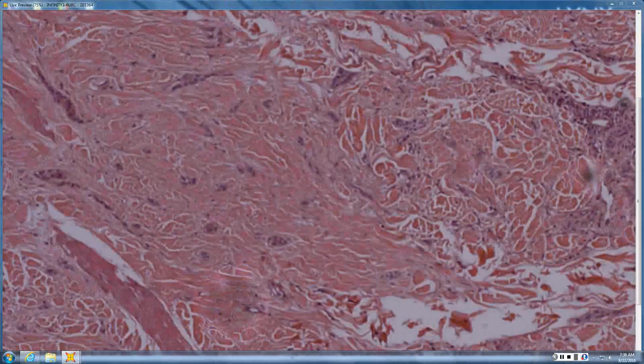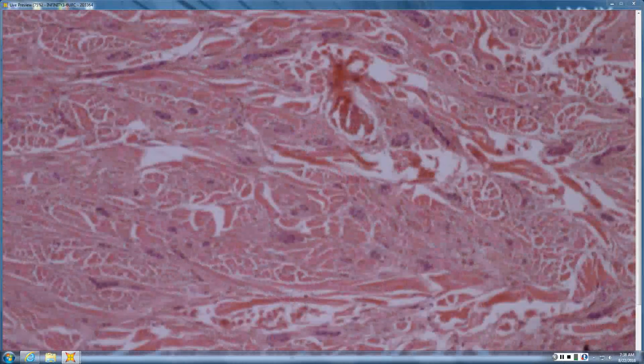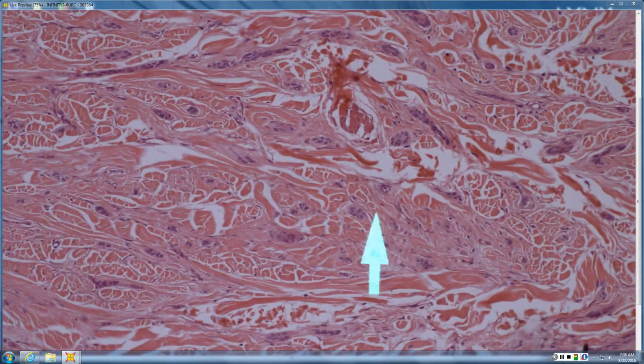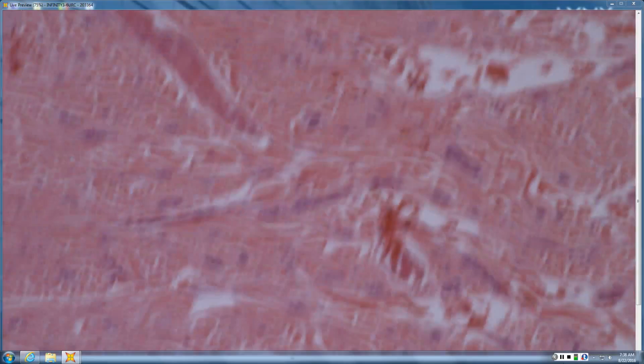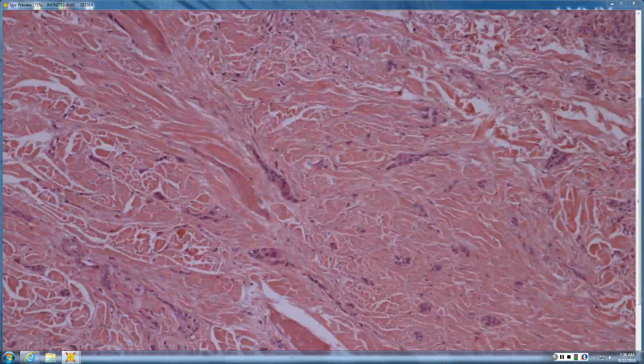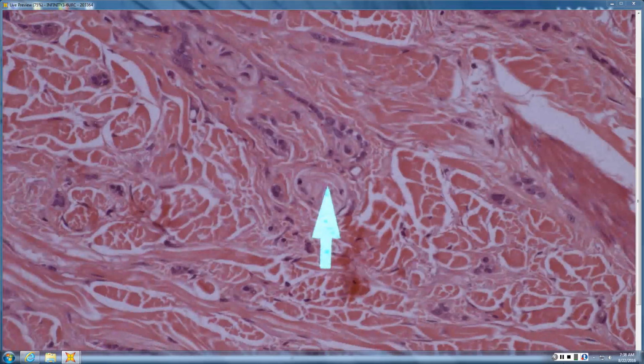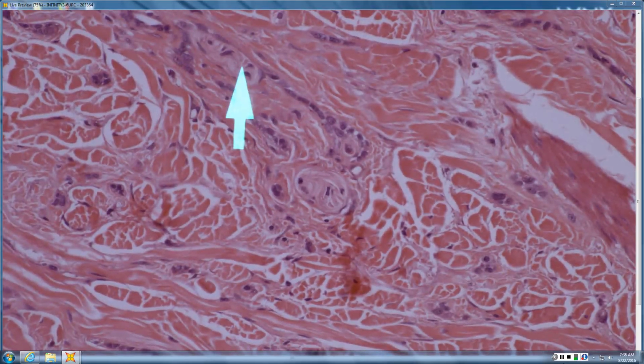Okay, Rachel. All right, now this looks a little more paisley tie-ish. Got like a pink sclerotic stroma. Does everyone notice I wore a version of a paisley tie today? We need to get some tadpole-shaped ducts. Yes, exactly. So they're kind of tadpole or paisley. So you think this is a syringoma? I don't really see any horn cysts or a lot of ducts. And what's that structure? It's a nerve. Yeah, nerve. So we've got some perineural invasion, which makes this a bad thing. Even these teeny weeny nerves are showing evidence of perineural invasion.